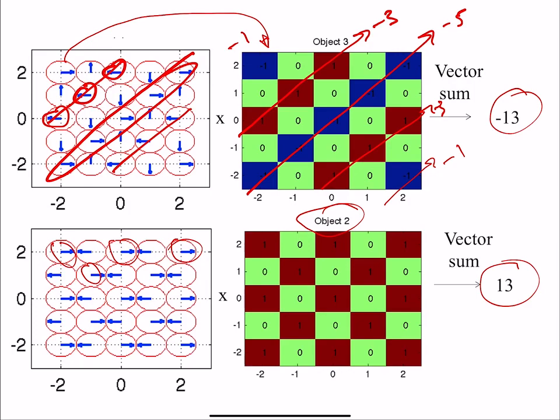But you could use that information, let's say someone just showed you the Fourier transform of an object. That's actually a good problem to put on a quiz. If I show you the Fourier transform of an object, you should be able to guess what the object might look like, as long as the peaks are big enough, right? So if I gave you a Fourier transform where there was some energy out there, you would know that the object should have stripes in it. And you should know which angle the stripes are at. Okay? But the fact that it had a lot of energy at that point in K-space, that's just due to what the object had. Okay.